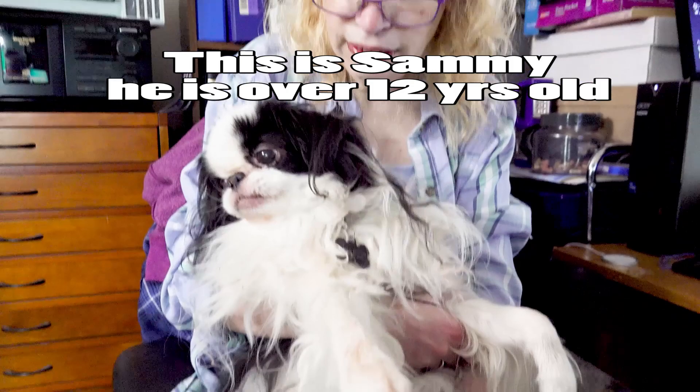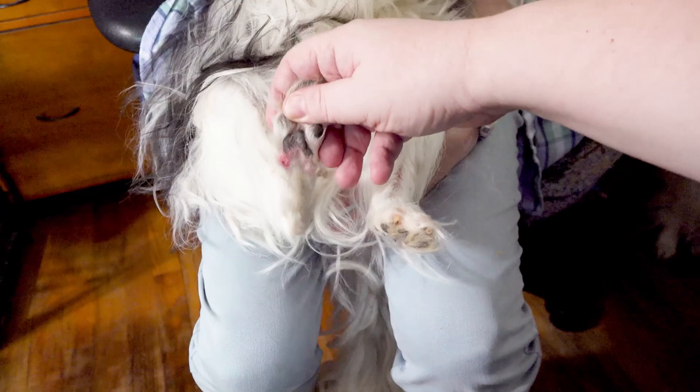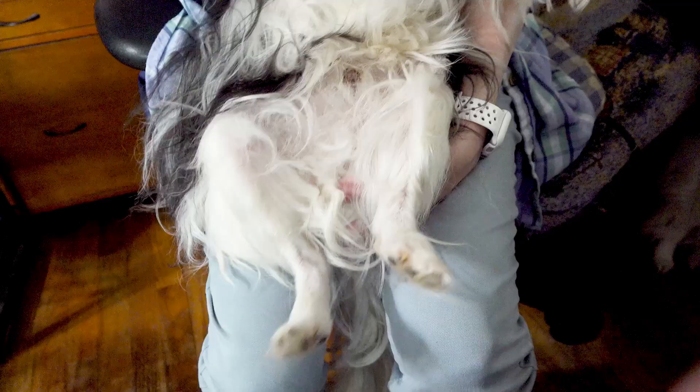This is a two-person job — you've got to get someone to hold the dog. We're going to go down here and poke the pad. You're going to want to make sure you shave off all the hair down here, because the hair will absorb some of the blood.